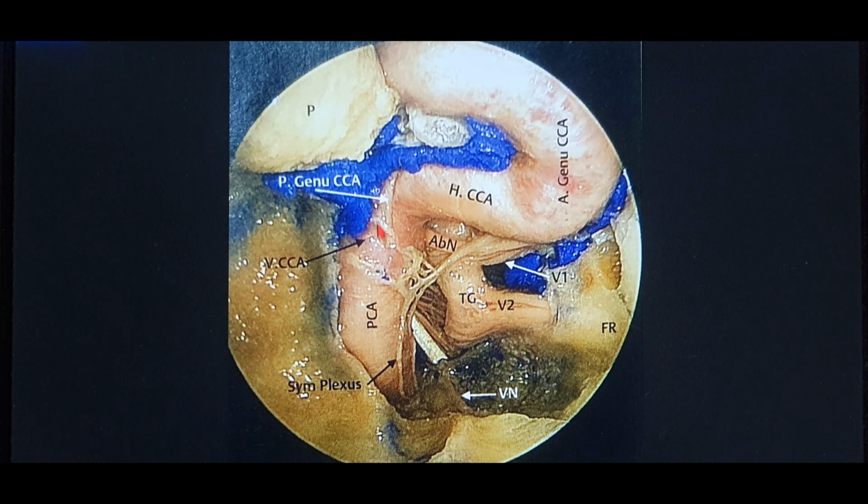So we have a short vertical segment, a posterior genu, a horizontal segment, and one anterior genu. This part of the carotid makes up the cavernous carotid, and this is the paraclival carotid. And as you can see over here, that's the nerve which I was talking about, which crosses the lateral segment, right over here. So once you locate that nerve, you locate the internal carotid artery. So that's the cavernous carotid.